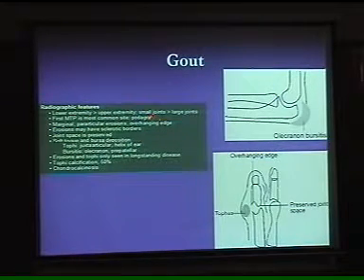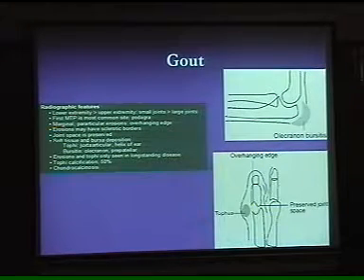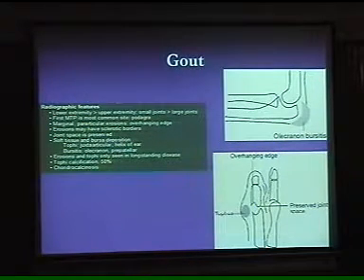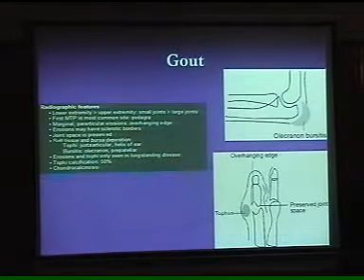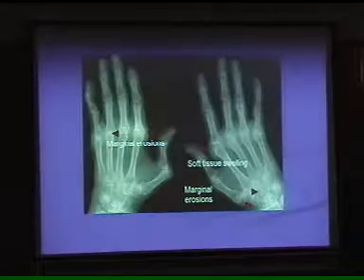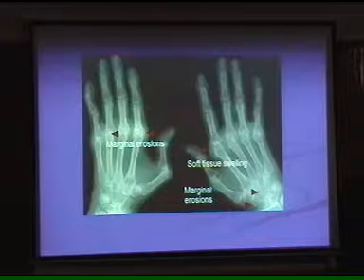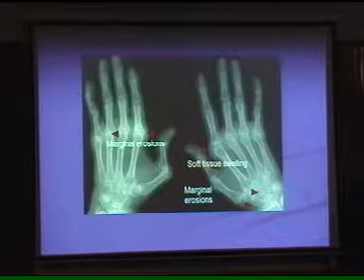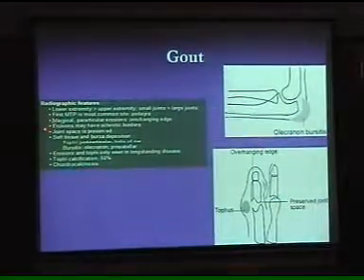But the lower extremity, upper extremity, small joints, that's the way it gradually spreads, first of all here and then gradually. The first metatarsophalangeal joint is the most common site, the big toe, as I told you earlier. Marginal paraarticular, that is the diagnostic sign. In rheumatoid arthritis, it is subarticular, just above the opposite bones, like this. But in gout, this is the area, periarticular, where the synovial membrane is finishing, then the erosion starts. But in cases of rheumatoid arthritis, you can find these erosions in the articular space.